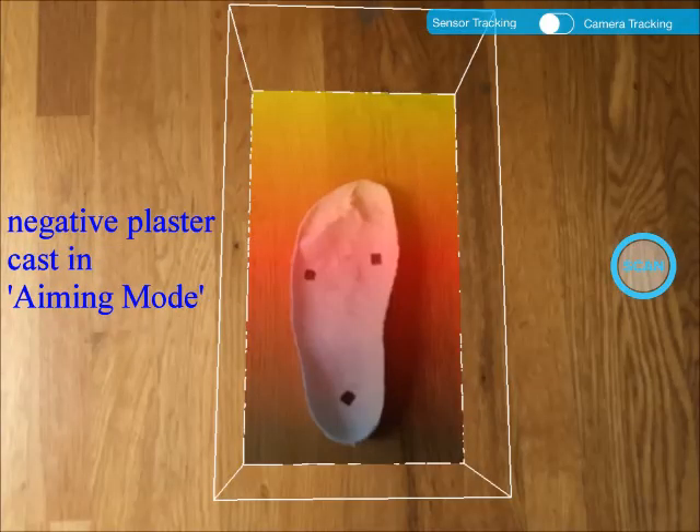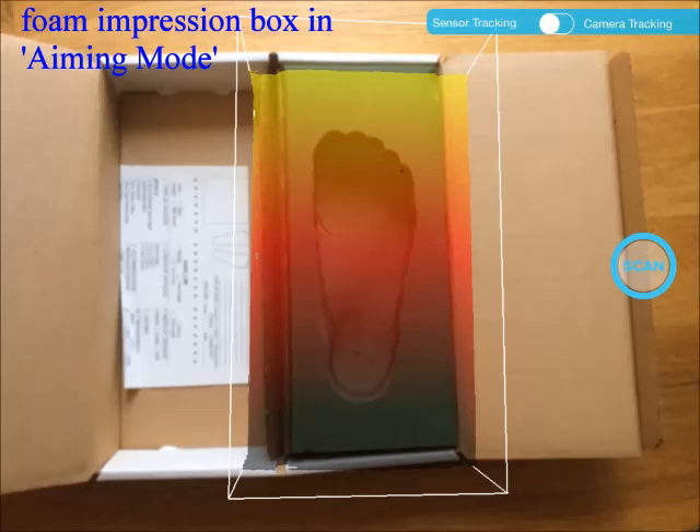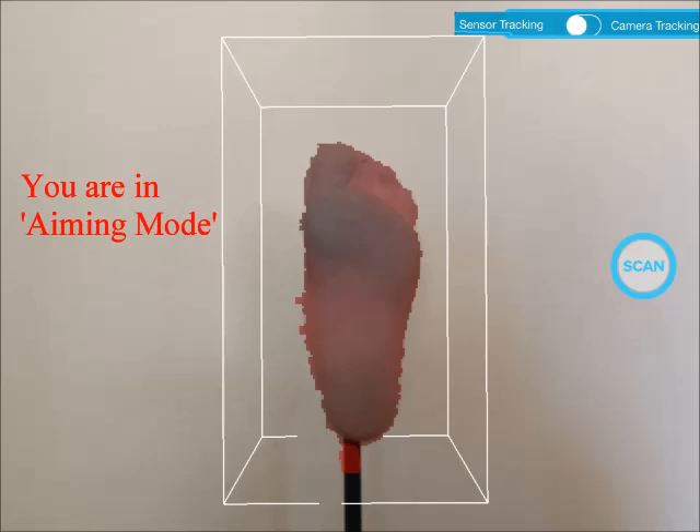We can also scan a negative plaster cast — that is the slipper cast, as shown in this screenshot. We need to trim the negative cast in order to scan the inside shape of the cast. We can also scan a foam impression box as shown in this screenshot. We need to scan them one at a time.